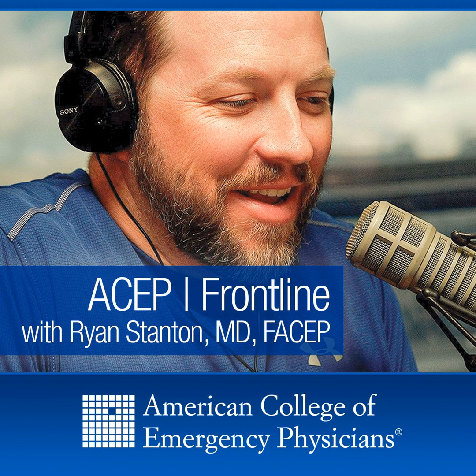But once you get beyond the views, some of the most overcalled things we see are whether someone has a good EF or not. An EF means ejection fraction. In the code arena, of course, no one has an ejection fraction. So that actually makes it really difficult to tell what your heart is doing when it's not beating. So looking for some of these etiologies might be difficult when it doesn't look as normal as you practiced in a lab.